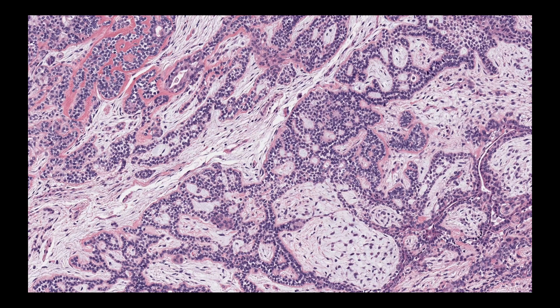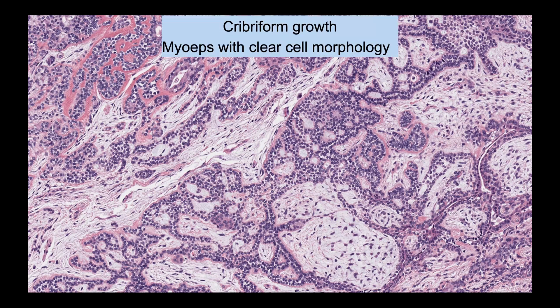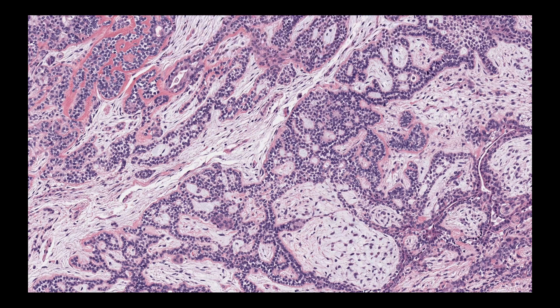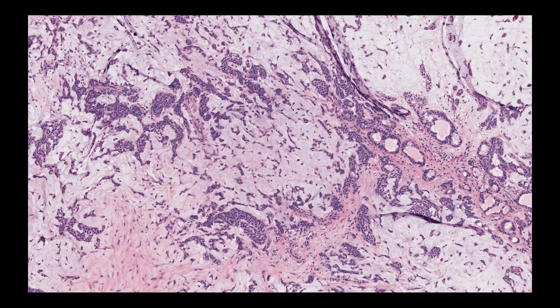Sometimes the tubular structures fuse and form cribriform formations, which might remind you of adenoid cystic carcinoma — one of the main differential diagnoses of pleomorphic adenoma. You may also see compressed tubular structures forming cords and microtrabeculae, with myoepithelial cells trickling into the surrounding fibromyxoid stroma.